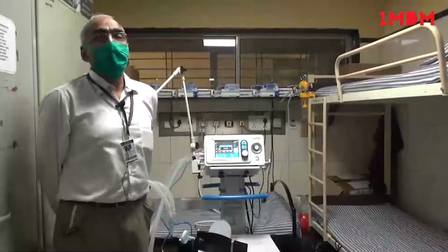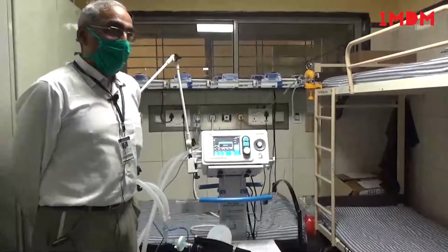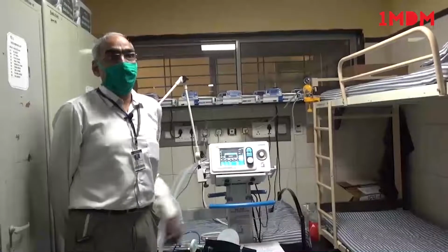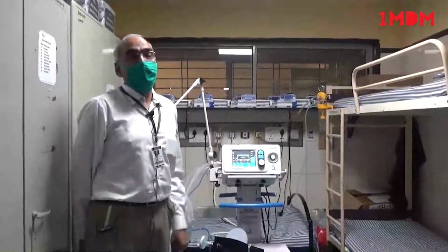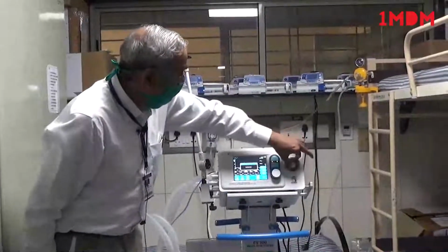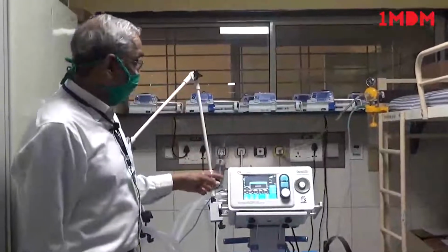So how do you think you're going to manage this scenario? Now, when a patient desaturates to 85%, the next thing to look at is if the pulse and blood pressure are stable. If the pulse and blood pressure are stable, you've got a good plethysmograph. The first thing is, if you're not already on 100% oxygen, you make it 100% on the ventilator. Okay, so I was on 50%, so I'm making it 100%. So this is a safety measure.